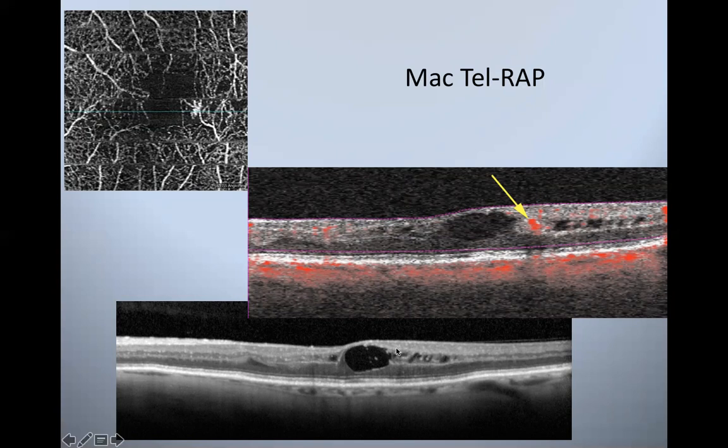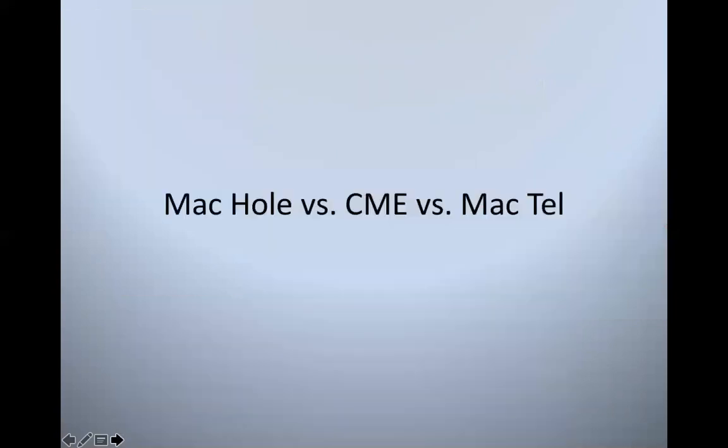So if you do an OCT on a patient and you see subretinal fluid and they say, oh, the patient has a neovascular complex, but you see along with it intraretinal fluid, the first thing you should think of is, this may be a RAP lesion. That has to do with OCT, not OCT-A, but just as an aside.